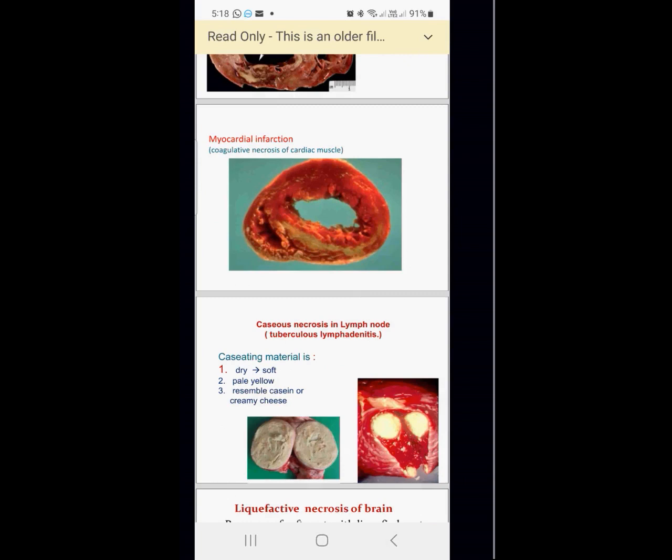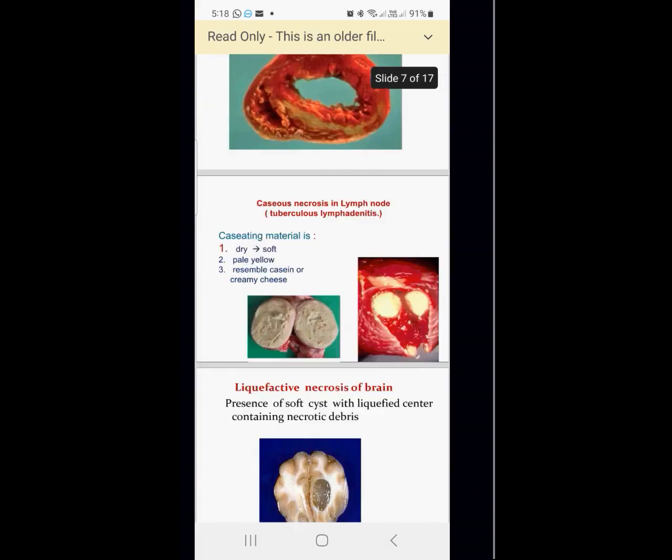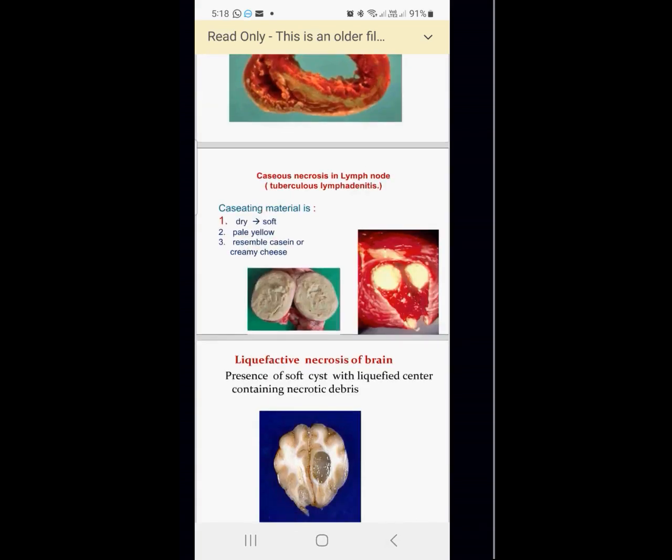Very characteristic. الcaseous necrosis أول ما تقطع تعرفها tuberculosis زي الجبنة، بتفتوي زي الجبنة, cheesy-like appearance, and it's like a whitish, and it's found in a circular manner because الcaseous necrosis occurs in the middle of the necrotic area, caseating materials. So it usually appears in the circular or a very demarcated features.